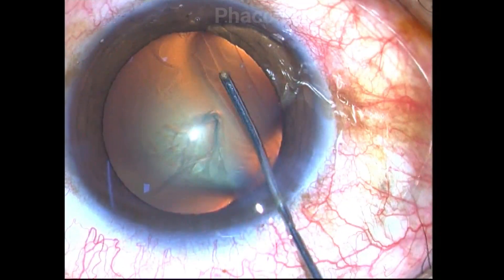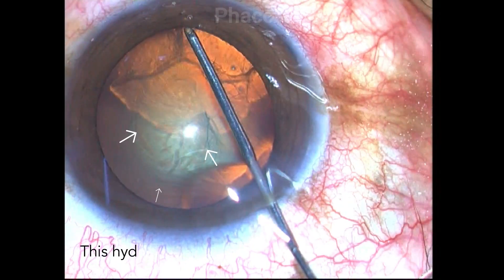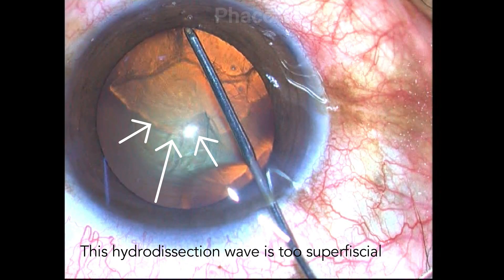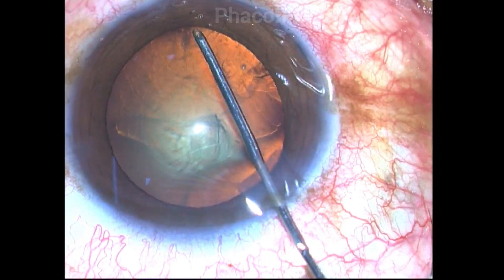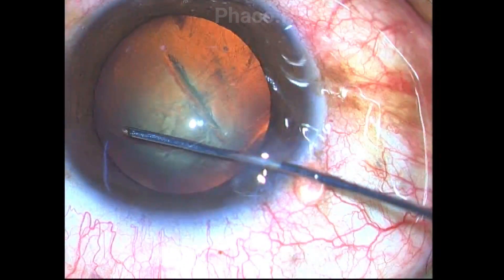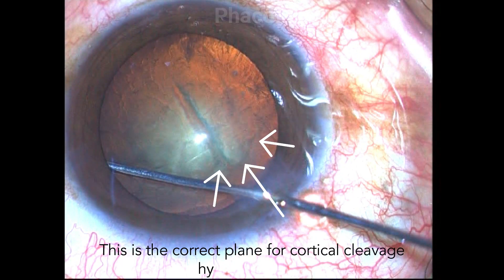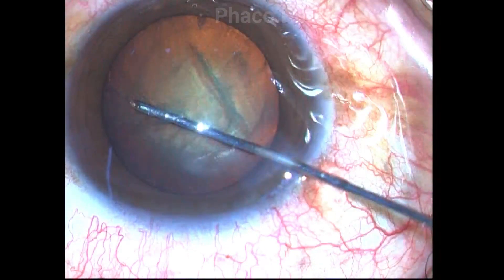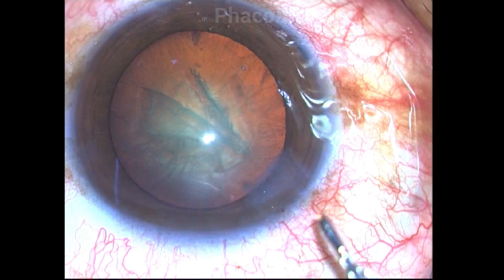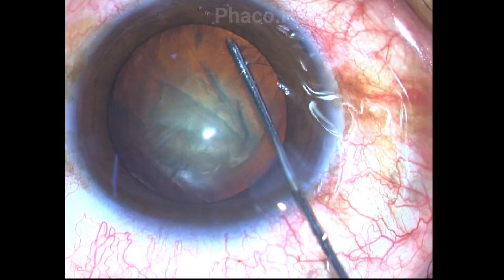By performing hydrodissection, I realized that in my initial attempt the fluid wave does not progress well. Probably I did not get the plane right, so I start at another location and this time I am successful in creating a satisfactory cortical cleavage hydrodissection. It is very important to get the right plane to enable the nucleus to rotate.